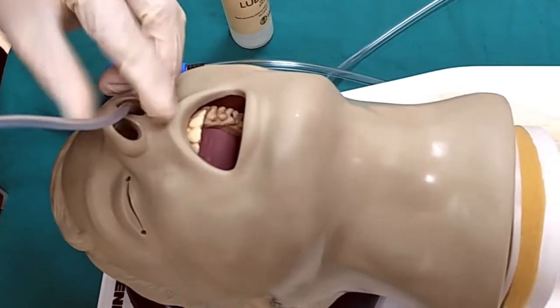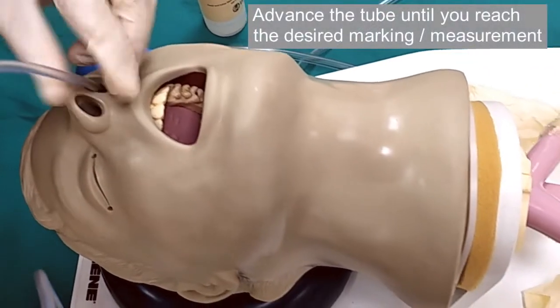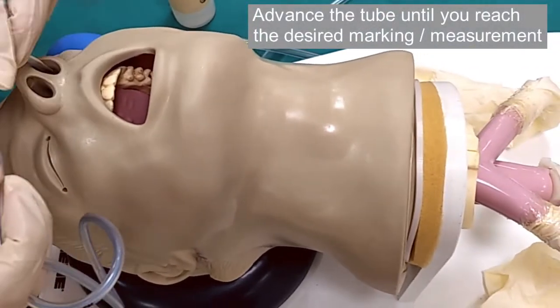Advance the nasogastric tube until you see the marking or measurement that you obtained earlier at the edge of the nostril.